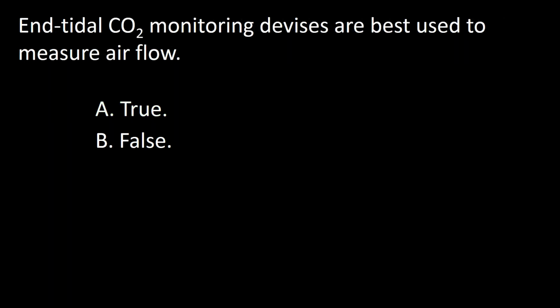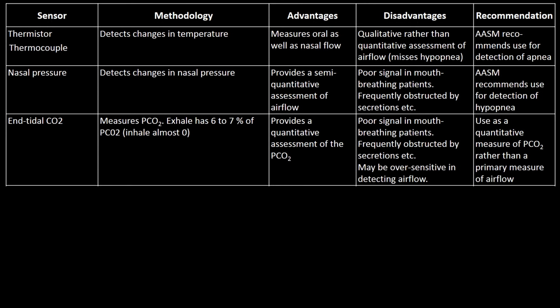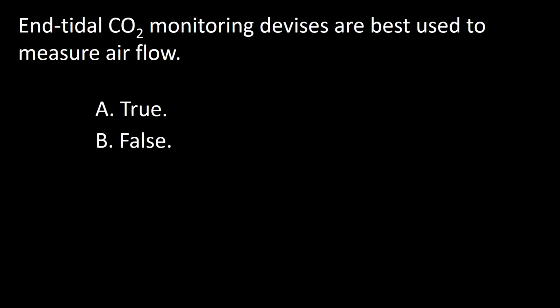Next question. End tidal CO2 monitoring devices are best used to measure airflow. A true, B false. End tidal CO2 monitoring measures CO2 but not airflow. So the answer to this question is B.